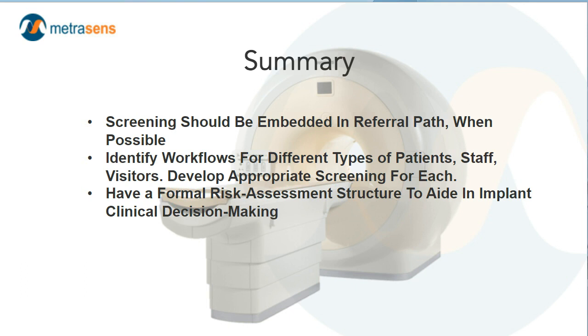Identify the workflows for the different types of patients, your staff, visitors, and develop appropriate screening processes for each. For example, if you have a back door into your MR area, you may want to have ferromagnetic detection screeners and belonging storage at that back door side entrance.